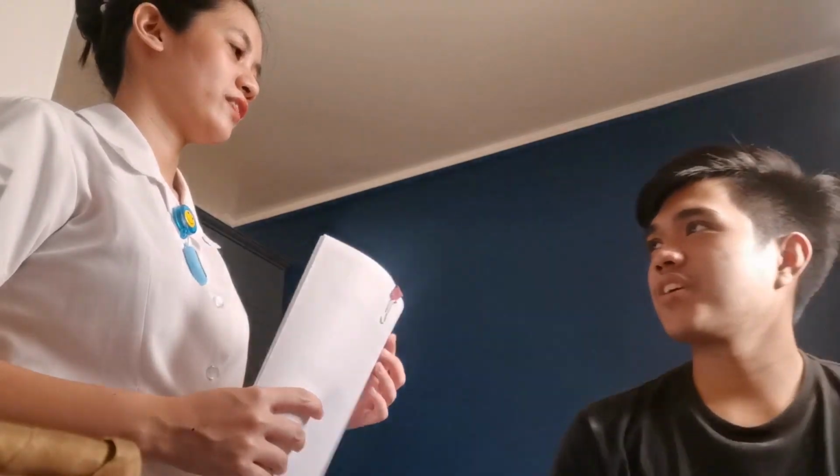Hello po sir, magandang hapon po. My name is Nikki po. I'm a first-year student nurse. Ako po yung nurse niyo para sa araw na to. So, base po sa medical records niyo, ang inyong pangalan ay si Mr. Detoyato. Yes po. Ano po mas gusto niyong itawag ko sa inyo? Yun na lang po, Mr. Detoyato. Okay po, sir. Kamusta naman po kayo, Mr. Detoyato? Okay lang po.